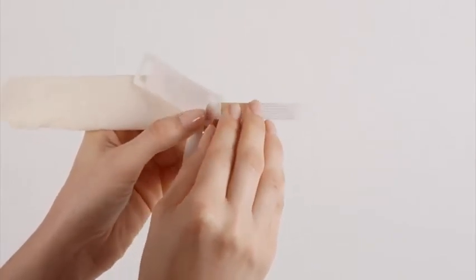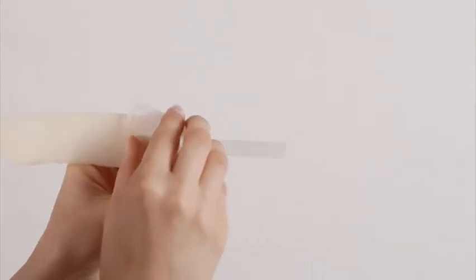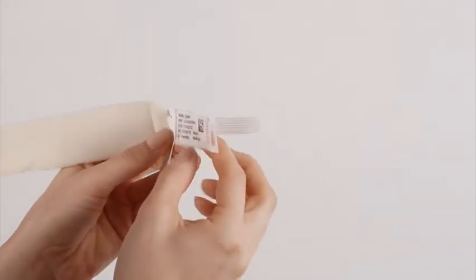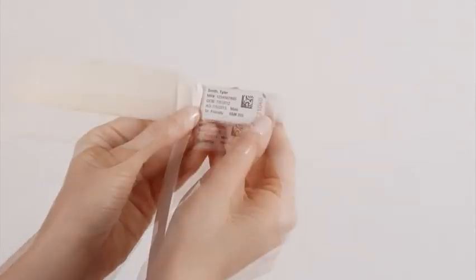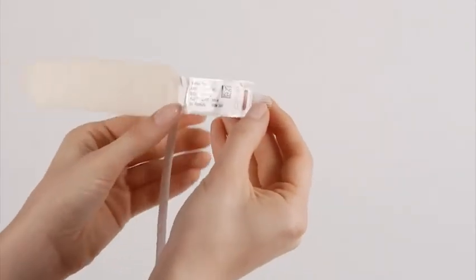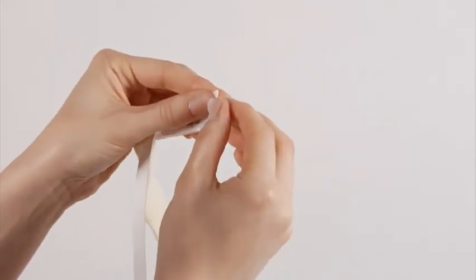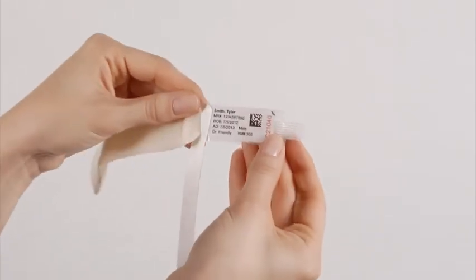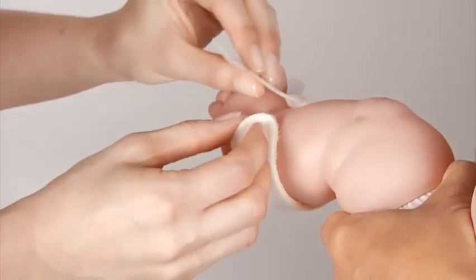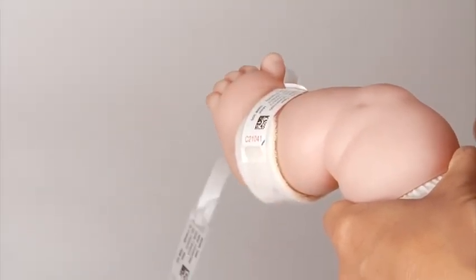To use the Laserband Infant ID tag with the Comfy Cuff, insert the Velcro tab of the Comfy Cuff into the front of the assembled ID tag's first slot. Remove the adhesive covering and insert it into the second slot of the ID tag. Smooth over it to create a secure seal.